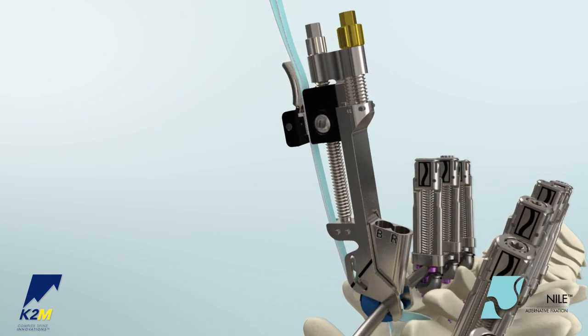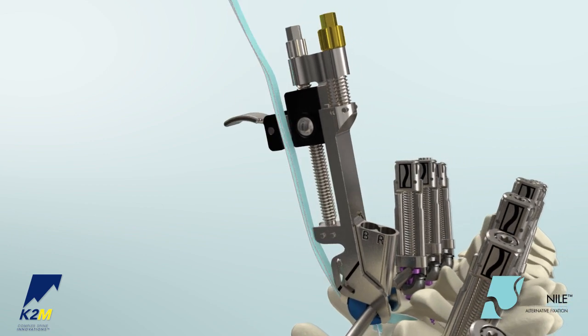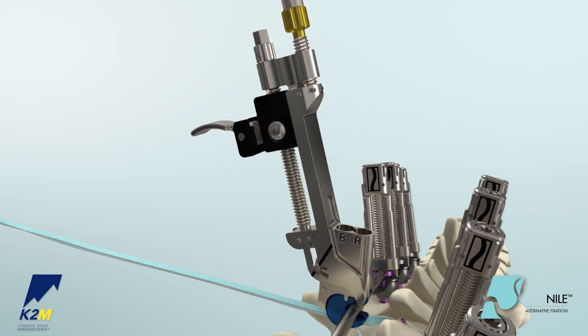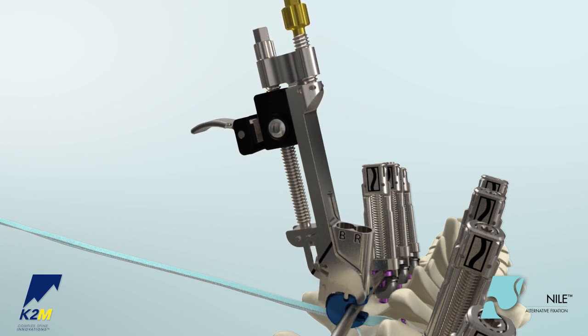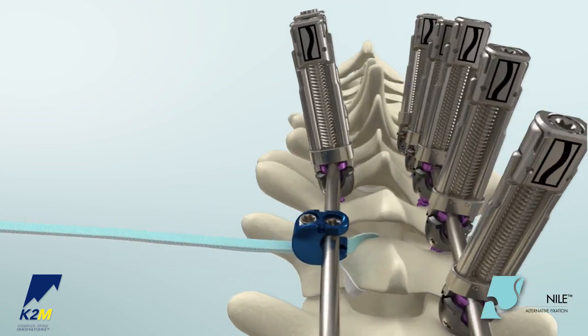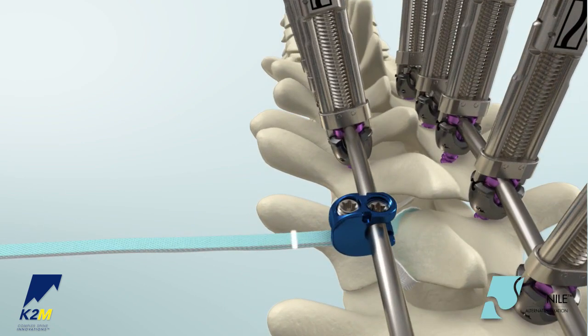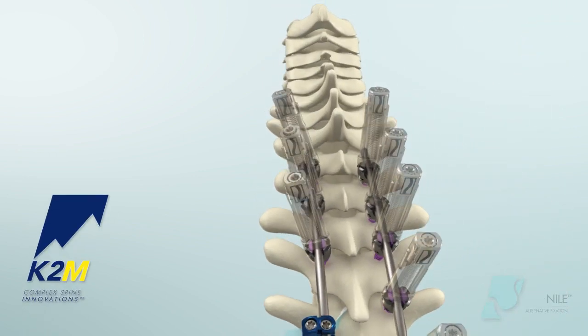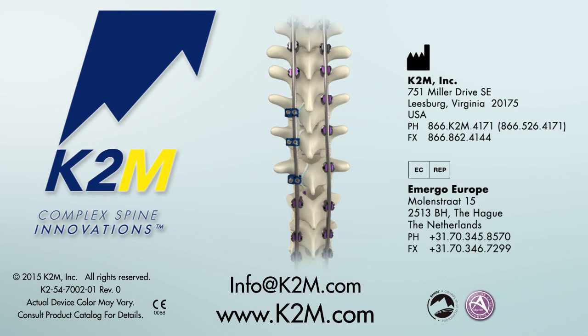To remove the band from the tensioner, flip the lever on the carrier down and disengage the band. Remove the tensioner from the clamp by turning the gold knob counterclockwise. Gently pull the tensioner out of the wound. The excess band is cut one centimeter from the clamp. Using electrocautery, burn the free extremities of the band to prevent fraying. Nile Alternative Fixation System from K2M, Complex Spine Innovations.